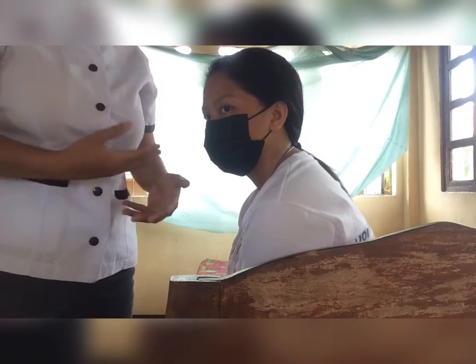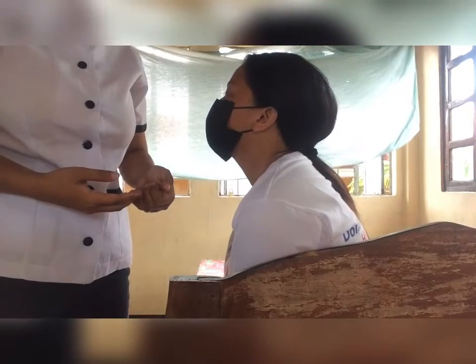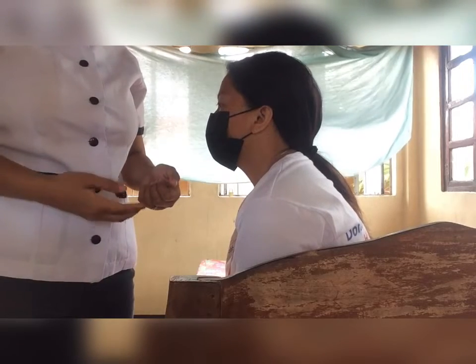Next, examine the ear canal and eardrum by using an otoscope. Position the patient's head so that you can see through the otoscope comfortably, and grasp it firmly and gently.